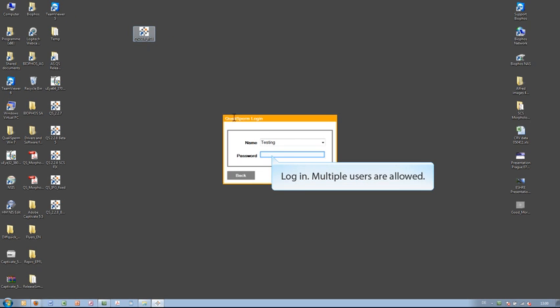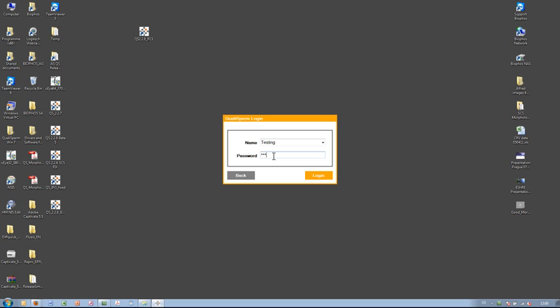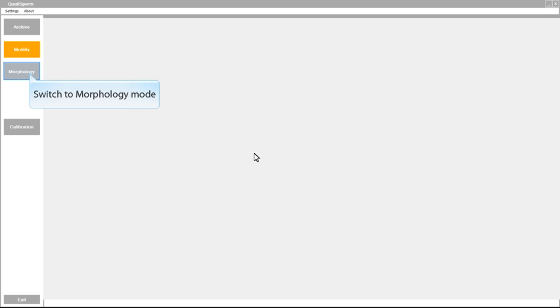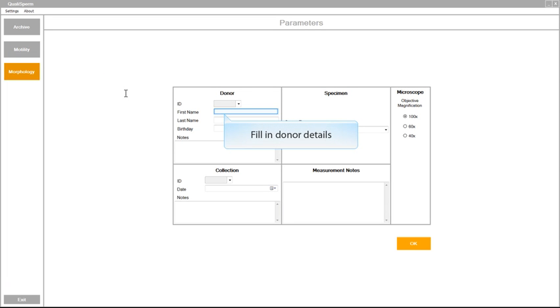Qualisperm is a multiple user system which enables login into your personal archive and measurement settings. Put your sample under the microscope, activate the morphology module and fill in your donor details.